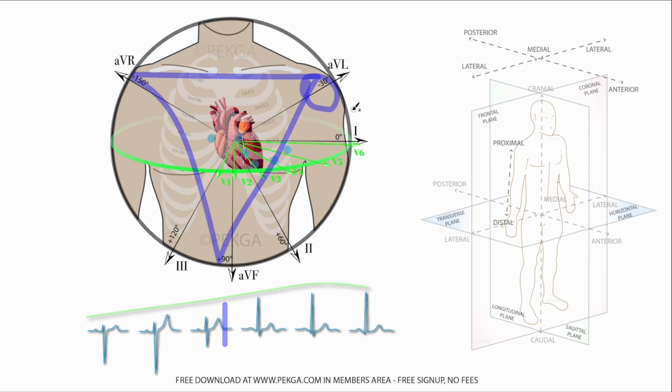Well, how can I explain this? Your axis related to lead 1 is composed of an electrode over here and an electrode over here, right? So there is an involvement on this side that could affect what's going on with AVL. So you have to double check this electrode as well. And again, it could have been placed down here on the right hand or arm versus the right shoulder. But the first one I would start with is your left shoulder or left arm.